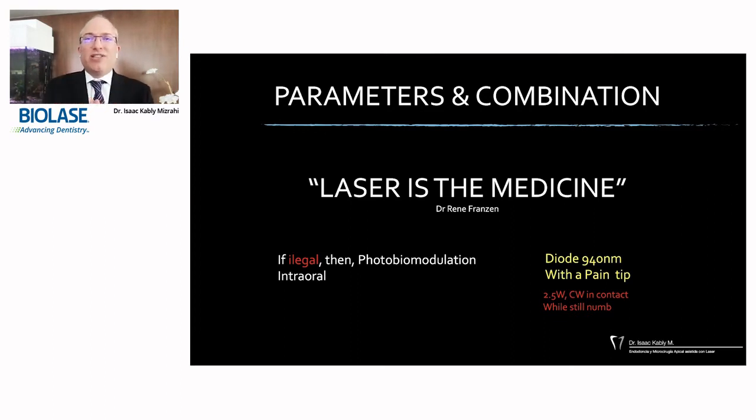And it is very important to do it on the same day of the treatment. There are some articles reported in literature that mention the importance of the photobiomodulation at the moment of the treatment, because the cells all around are really sensitive at that time of the treatment.